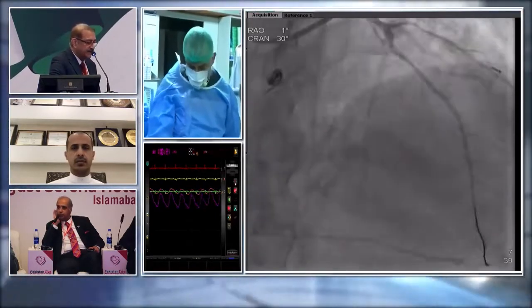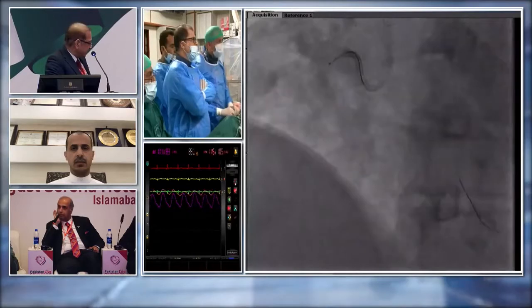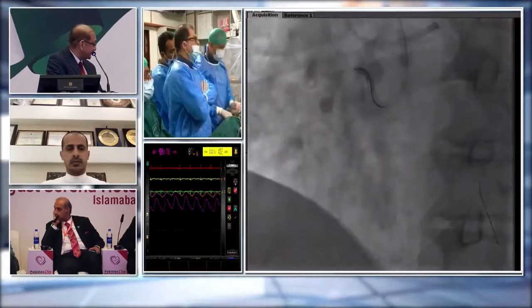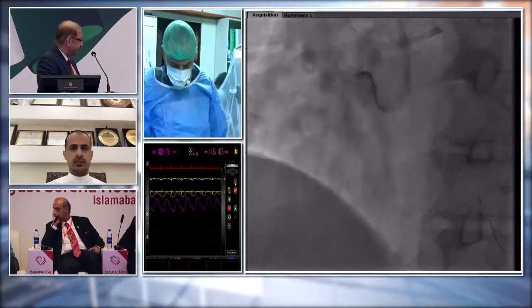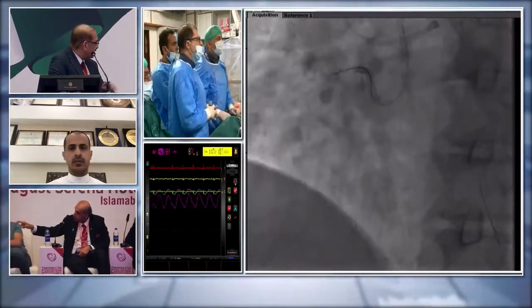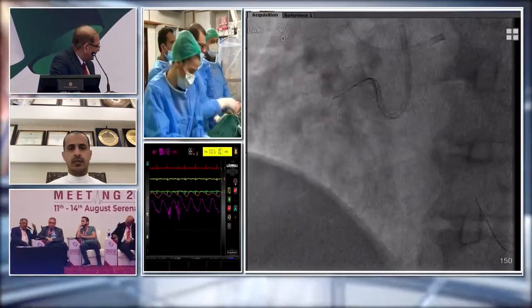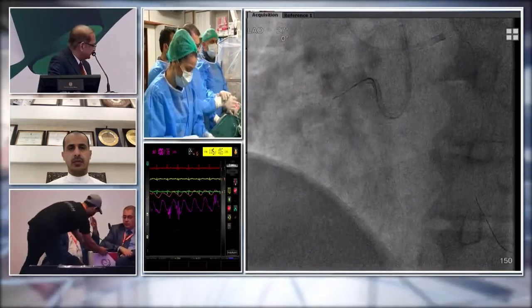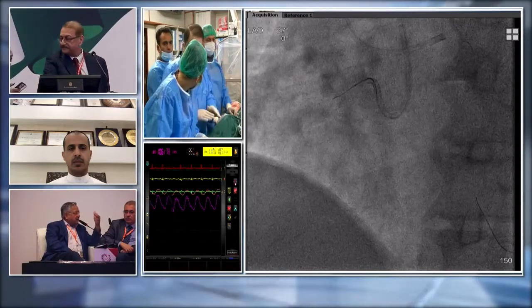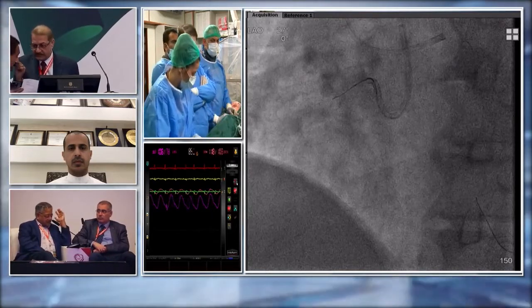Bilal Murad, I see you sitting over there wondering what you want to say. By the time they are setting up IVUS, can you just reframe your thoughts about what the risks are in this patient if he attempts the RCA first and ignores the left main? So your mic is off. Sorry? The conventional teaching is you shouldn't take on a relatively stable lesion if you have something like left main disease, because the thing that kills people in PCI is left main disease. Nothing else. And so left main has to be assessed before you go to work on a stable lesion. That's what the revascularization guidelines say, at least.